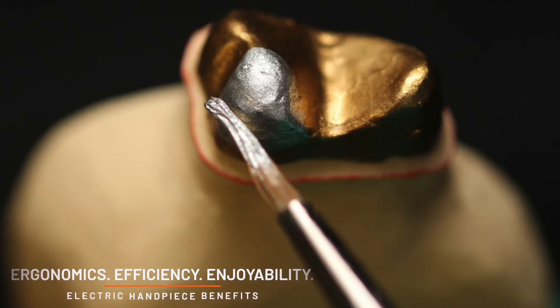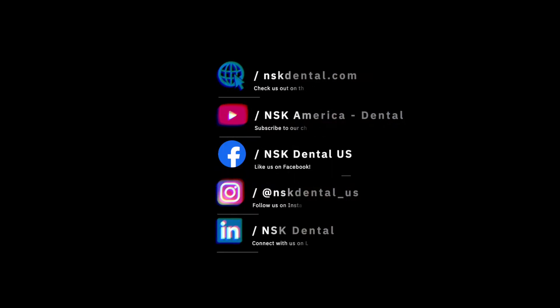These routine clinical cases highlight the ergonomics, efficiency, and enjoyability of utilizing an electric handpiece, which make the daily grind feel a little bit less like work.